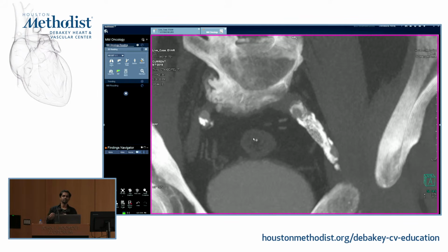But is it better to prepare upfront to know what stent it is, where it is, and the extent of it, or find that out in the OR? The concept I'm trying to pitch here is that it is your responsibility to extract as much information as you can from the CT to plan for your procedure. Nobody is going to do this for you. You have to do it. The tools are out there that can do it for you, but unfortunately, I don't know how much these kinds of imaging basics are covered in the vascular curriculum nowadays. This is one of the reasons I wanted to touch this topic.